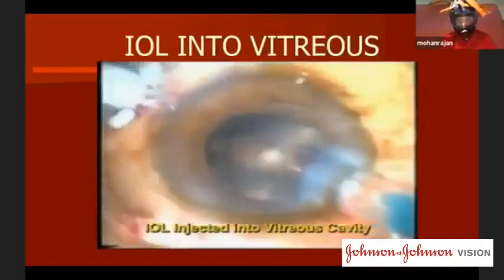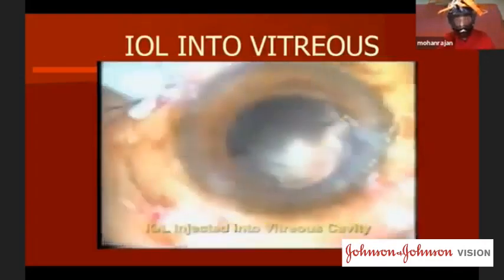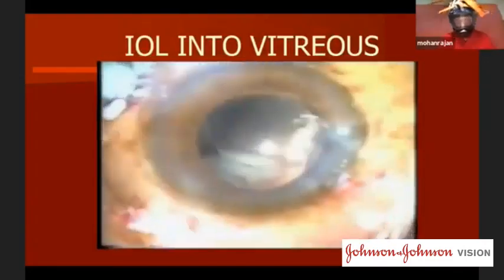Again, you have to be very careful of the shooters. A shooter can rupture the PC, and the IOL can drop into the vitreous. You can see the IOL dance into the vitreous as well.